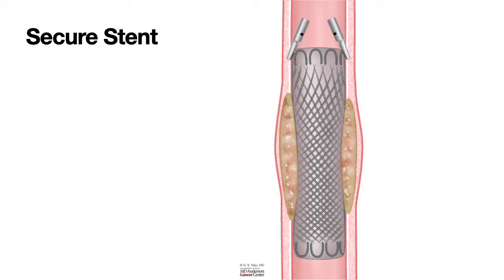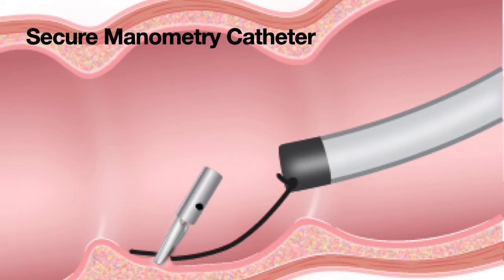And also some are trying a new suturing device that can be applied through the scope itself. So securing stents is another application, but the through the scope clips are not necessarily that great for this purpose.